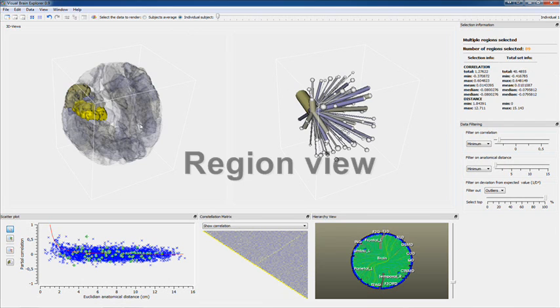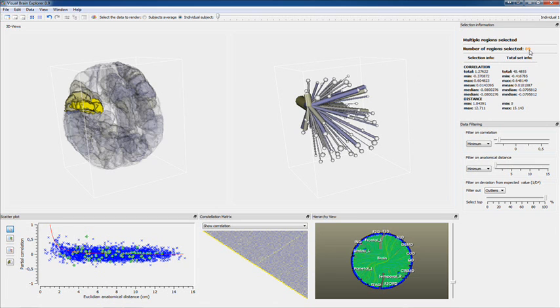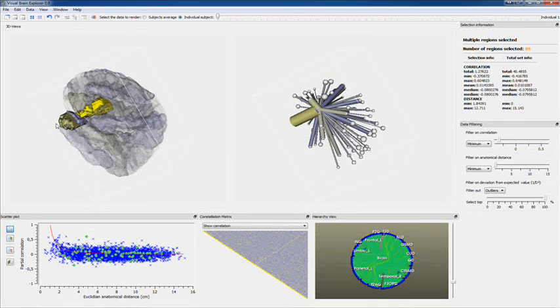What you can do more is click one region in the region view. A new view mode is entered where the opacity is based upon the correlation strength towards this region. These are 89 links you can see there. These are all the links towards this region, and you can quickly see if a region has some strange links attached to it.